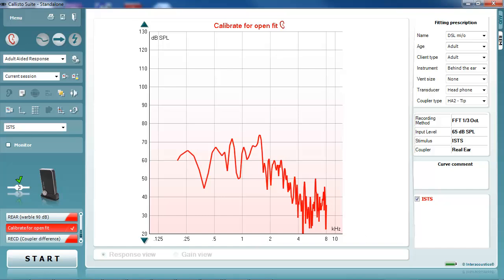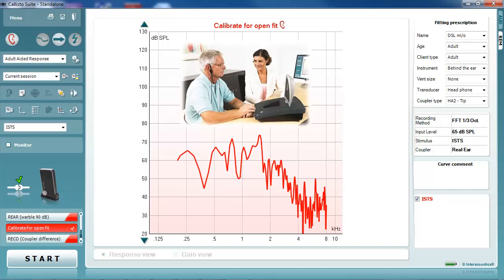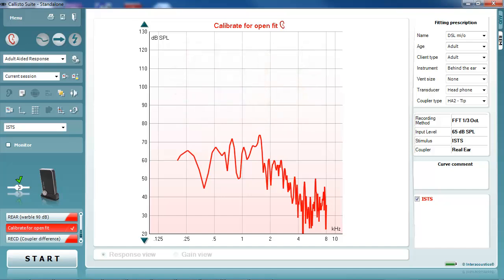It is important, however, to ensure that the patient maintains their position for the duration of the test, as stimulus corrections for patient movement will now not be performed by the software.